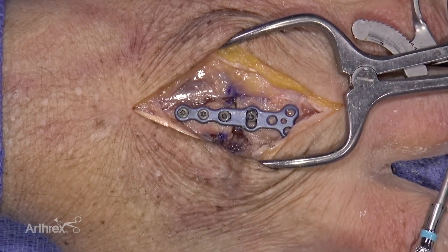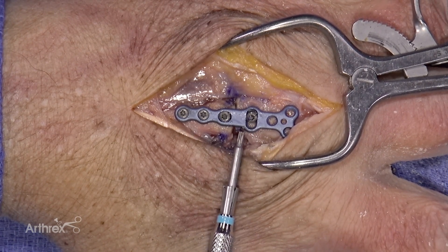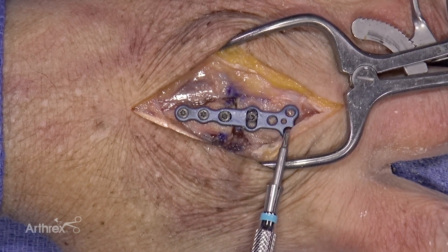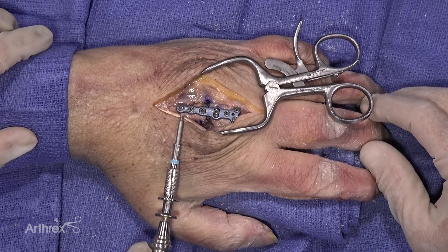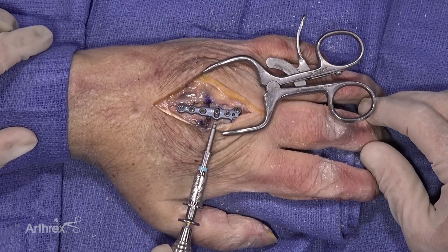The bicortical screw will maintain reduction of your osteotomy site and also maintain the improved rotation of the digit. Once this portion of the case is completed, the remainder holes can be filled with either cortical or locking screws to complete the fixation of the osteotomy. This is the complete fixation with all the screw holes filled, and you can see the amount of rotation correction achieved through the oblong hole.